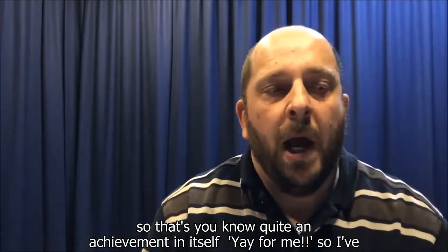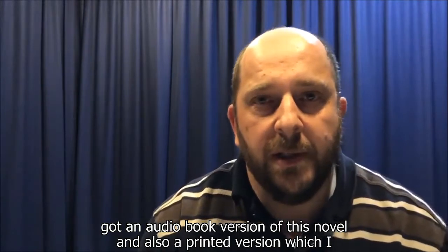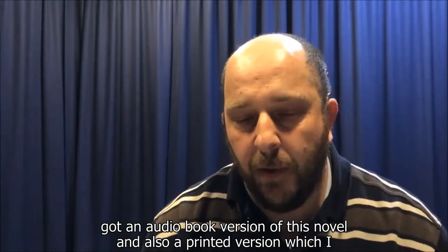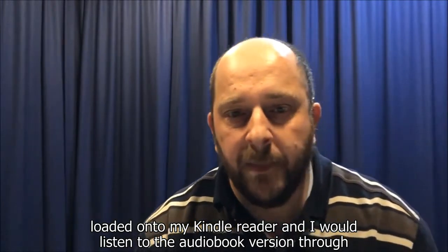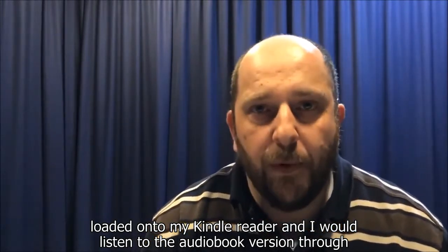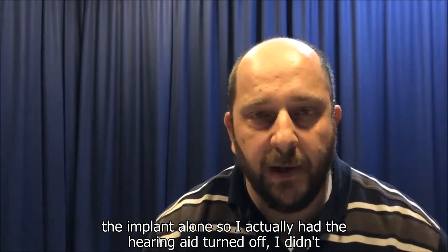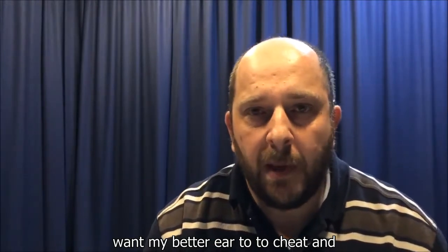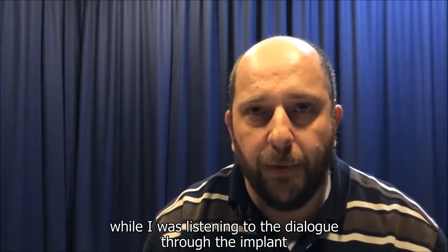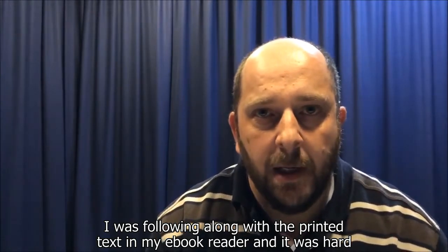Yay for me! So I got an audio book version of this novel, and also a printed version which I loaded onto my Kindle reader. And I would listen to the audiobook version through the implant alone. So I actually had the hearing aid turned off. I didn't want my better ear to cheat. And while I was listening to the dialogue through the implant, I was following along with the printed text in my ebook reader. And it was hard.